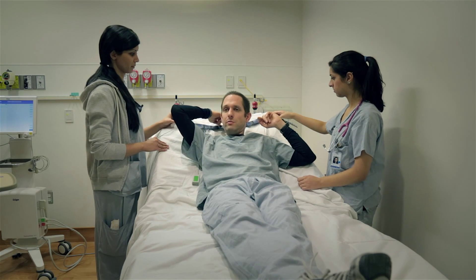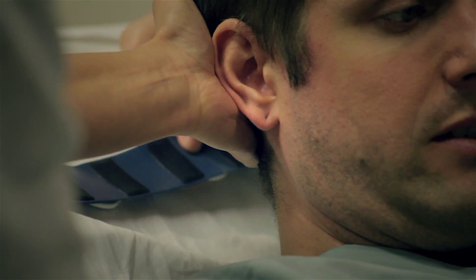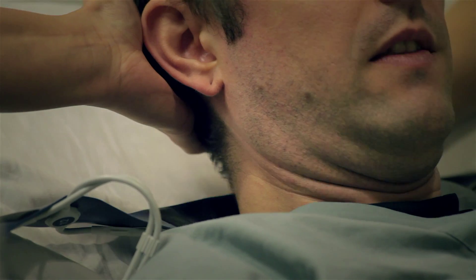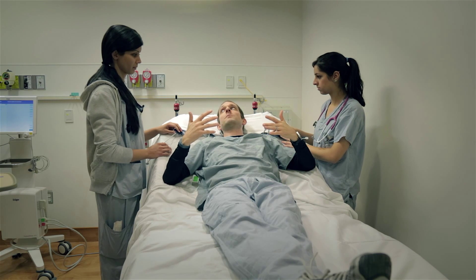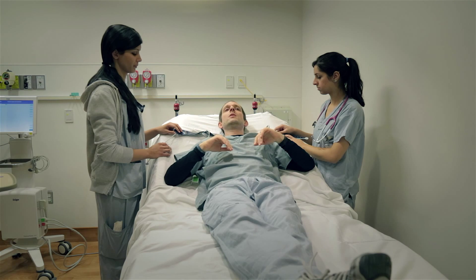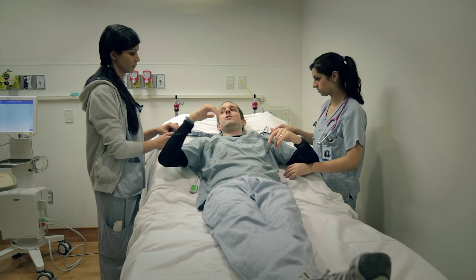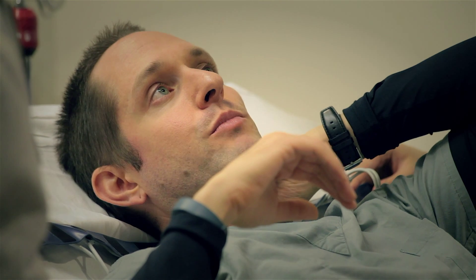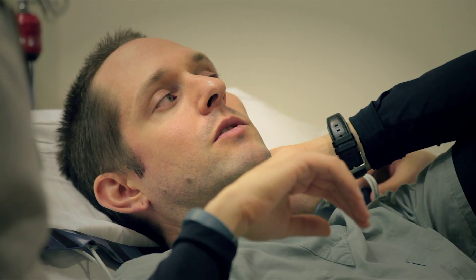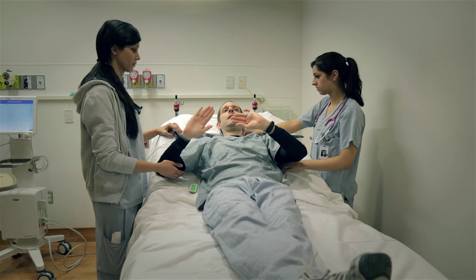Take the raised area and center it in the back — one of you finds it and slides the belt. One of you lifts the patient's head, and the other brings the raised area to the center of the neck, then the patient's head back down. This way, once you lift, you don't have to keep them raised very long. Put your arm under and grab onto the top shoulder on each side. Before you lift, bring your finger back and feel that raised piece. When you lift the patient, both of you pull down, focusing on bringing that raised piece right down the center of the back, feeling for the center and resting it there.